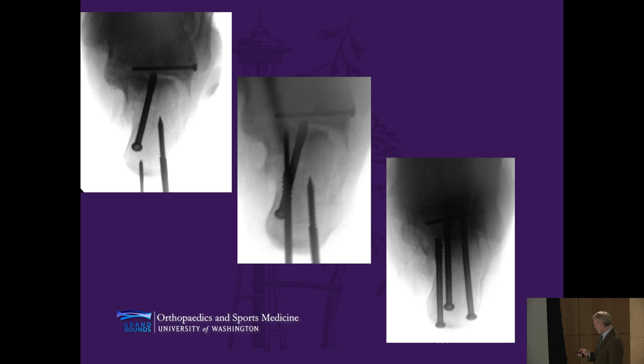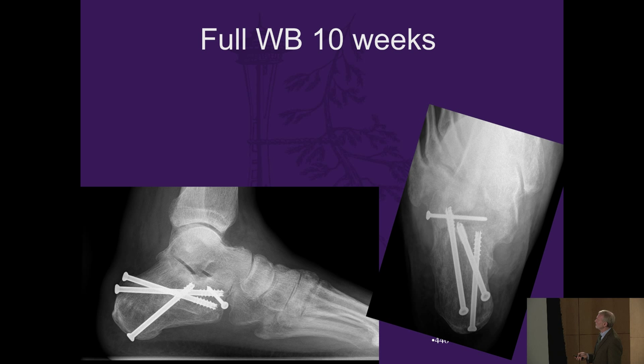Here's the patient at 6 weeks post-op, and here's the patient fully restored, with normal weight-bearing activities at 10 weeks. The comminution along the medial wall has now healed.